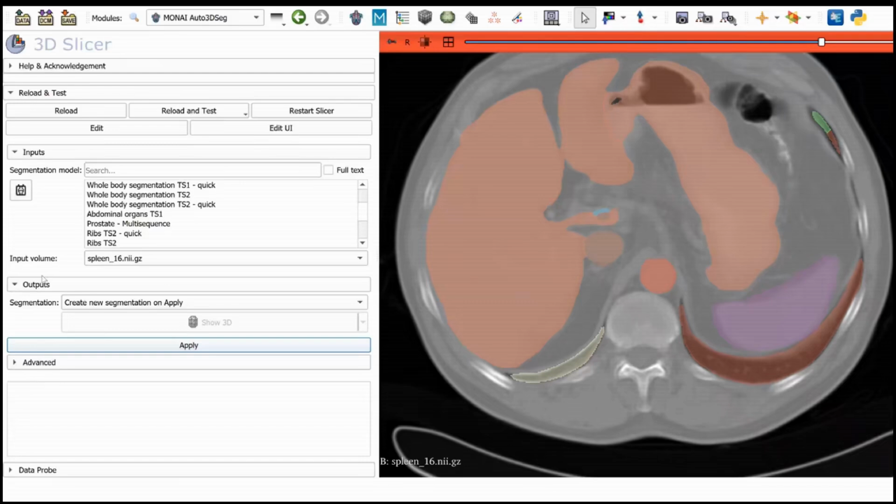We managed to do it only for inference, but also the SAM performance in medical images is not as great, because it mostly works on 2D, right? But yeah, there was an initiative to that, and we published a conference paper. We didn't integrate it into the core of MONAI Label.